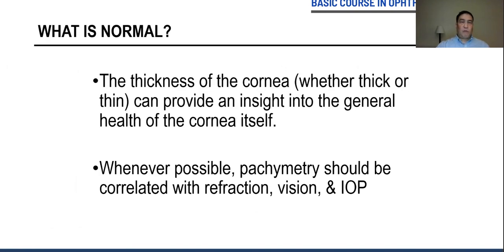Before we learn any of this, what's important for all of you is to know, what is normal? The thickness of the cornea, whether thick or thin, can provide an insight into the general health of the cornea itself. And whenever possible, pachymetry should be correlated with refraction, vision, and IOP.